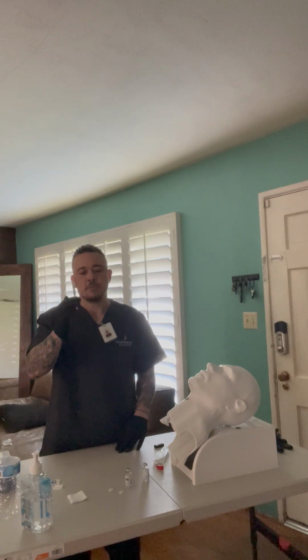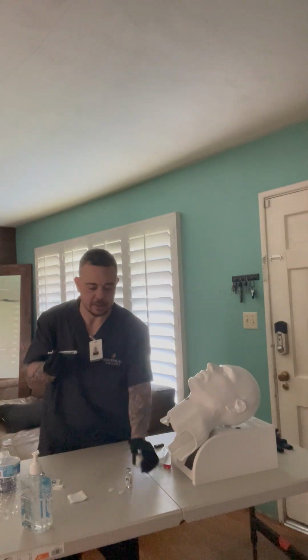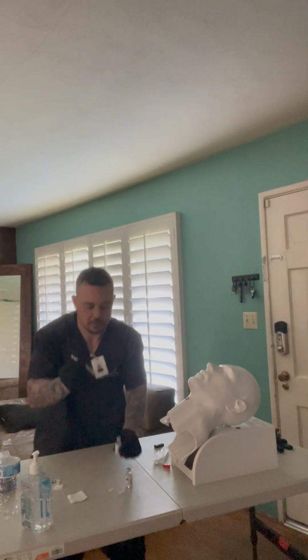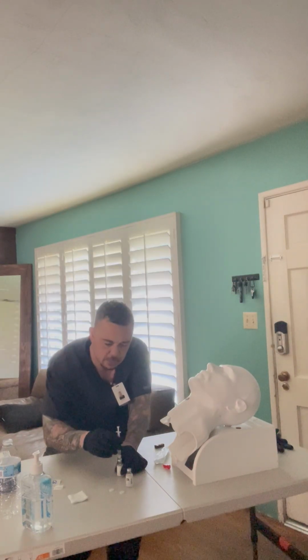And now the next thing I'm going to do is get the NPH, and I'm going to put this into the NPH vial. I'm not going to inject anything, I'm just putting this in here.